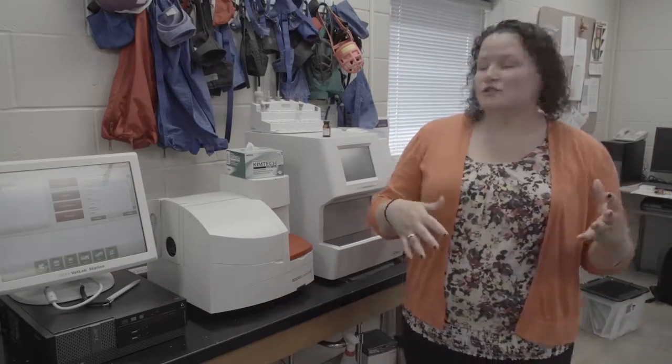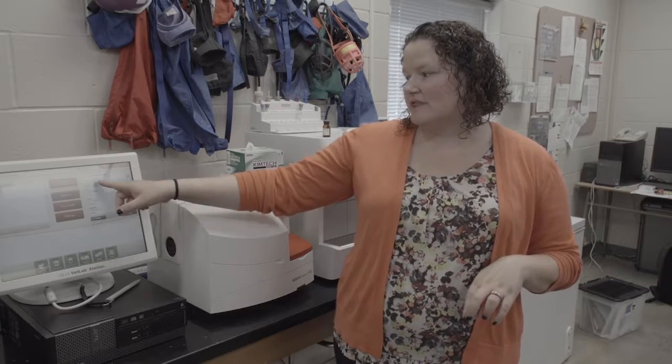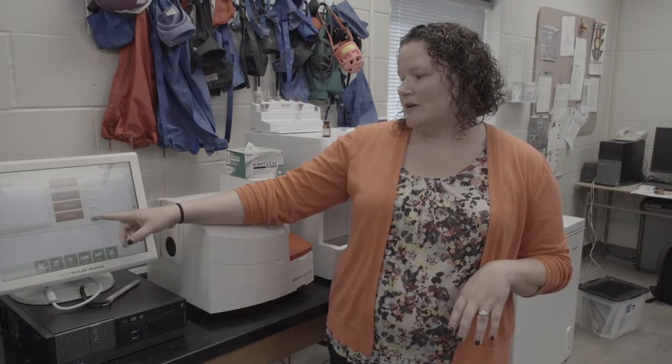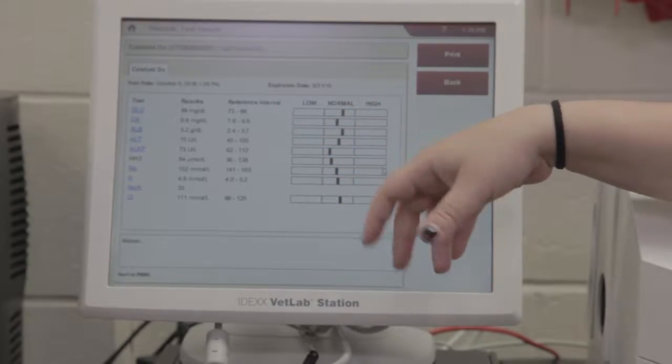Okay, so once your quality control on the catalyst is done, your results will be on the vet lab station. It's going to say Vetrol and then the lot number. If I tap on that and tap on view, it shows me all of my analytes and whether it was normal, low, or high. Like I said, if anything were low or high, you're going to want to call customer support and they'll talk you through how to troubleshoot that.